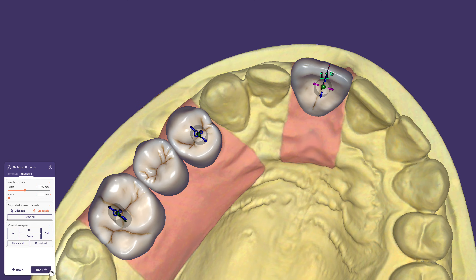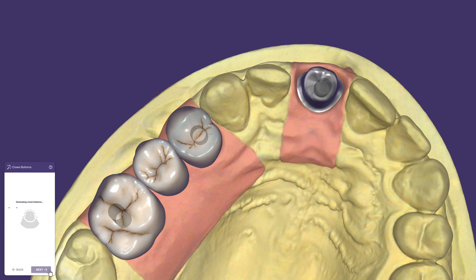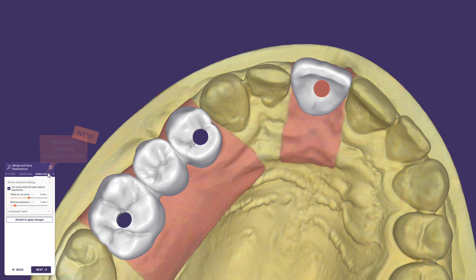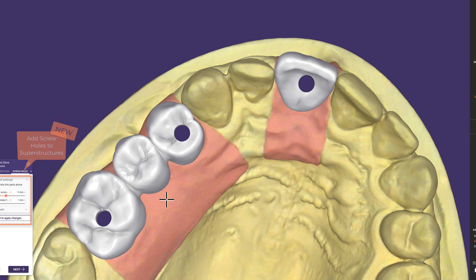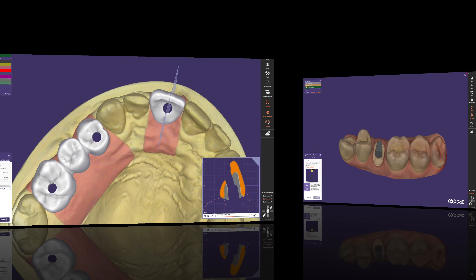Do you like to create screwmentable restorations? Now it's possible to include a screw hole into the design superstructure. This is how you can create easy access to the implant by taking the screw hole of the abutment into account.